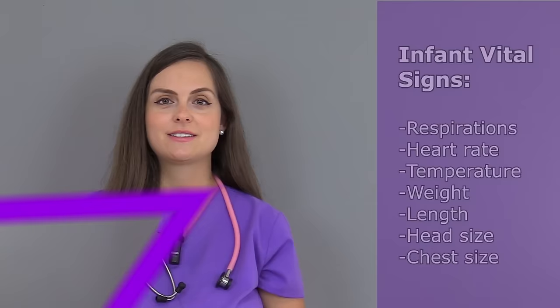Before you assess the infant's vital signs, you want to make sure that you gather your supplies. What you're going to need is an infant-sized stethoscope, a measuring tape, a thermometer, a scale, and a watch to count with. You'll want to make sure that you sanitize everything you're going to use on the infant before and after use, and of course perform hand hygiene before beginning.